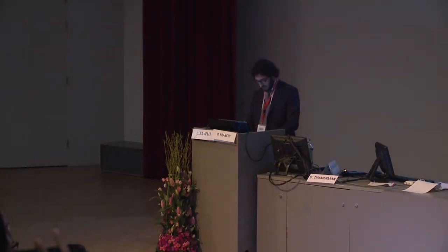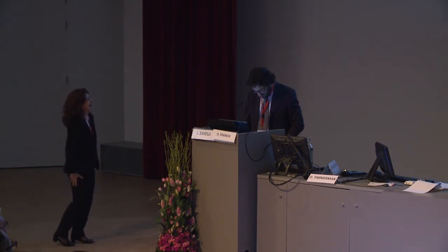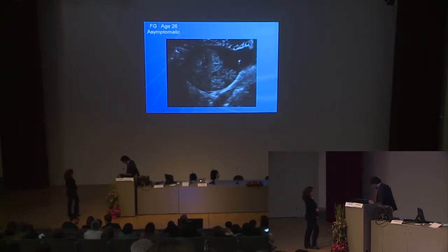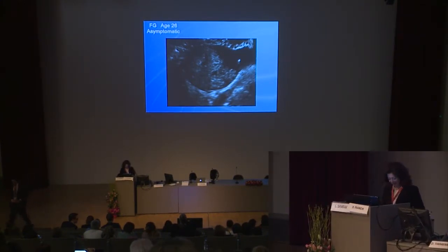Okay. But it's a false positive, so sorry for the oncologist. And we know struma ovarii is among those rare benign tumors that are false positives to many logistic regression models and so on. So we can go on with some other cases.